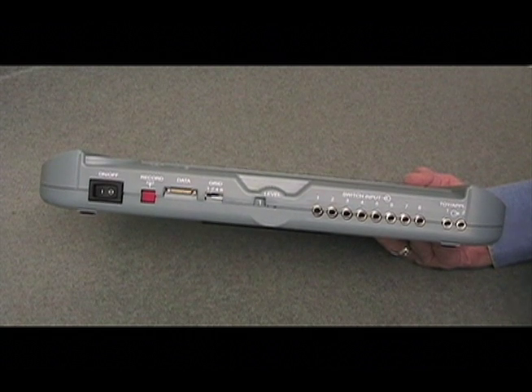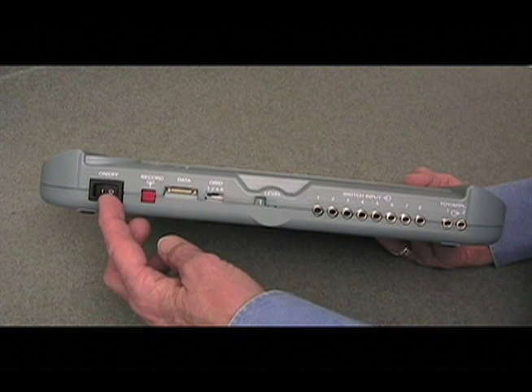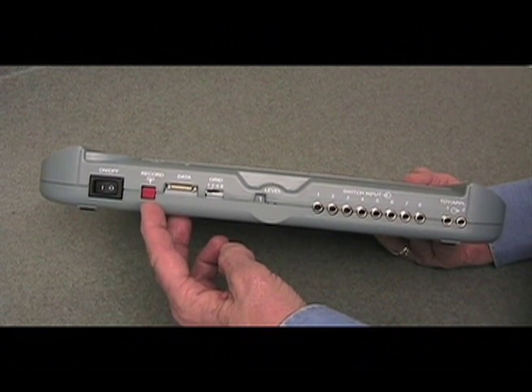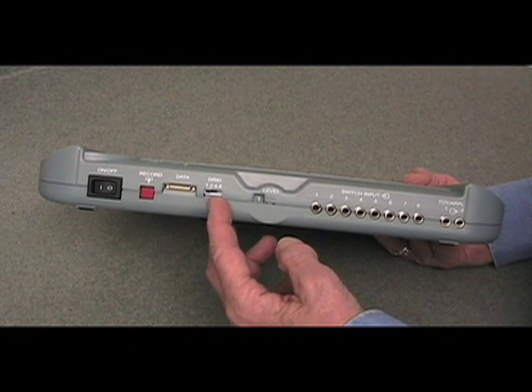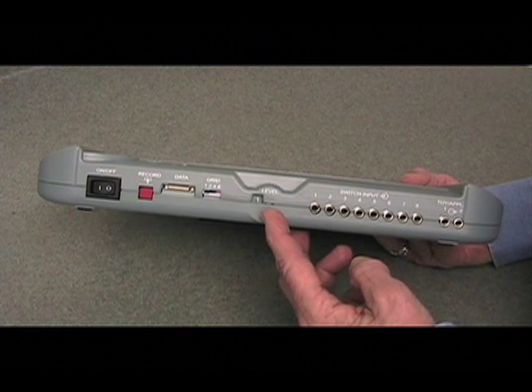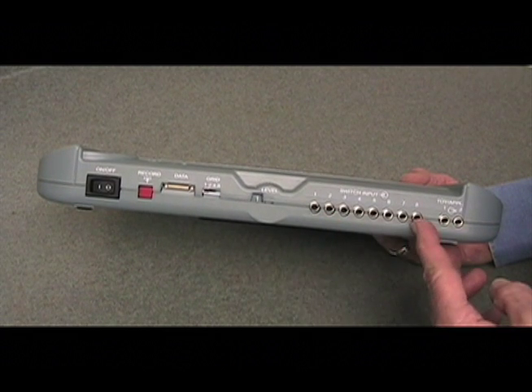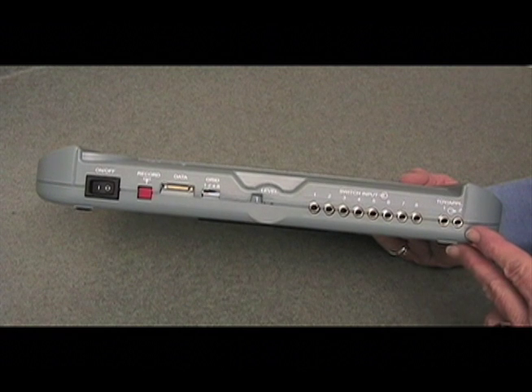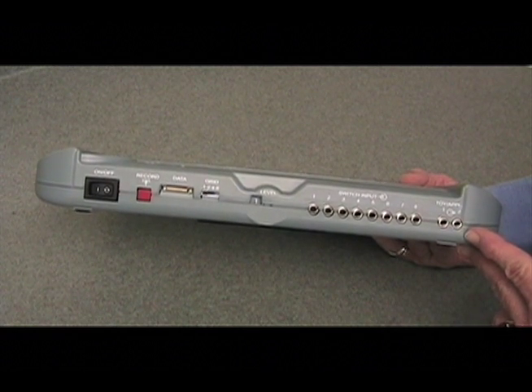On the back of the device we have many of the controls. The on-off switch to turn the device on and off. We have the record button. We have the grid settings so that you can match the setting to the grid that you're using on front. We have the level of your recordings, 1 through 8. We have the option of switch input, 1 through 8. And then we have the 2 jacks that you would use if you're wanting to operate toys or appliances with the device.